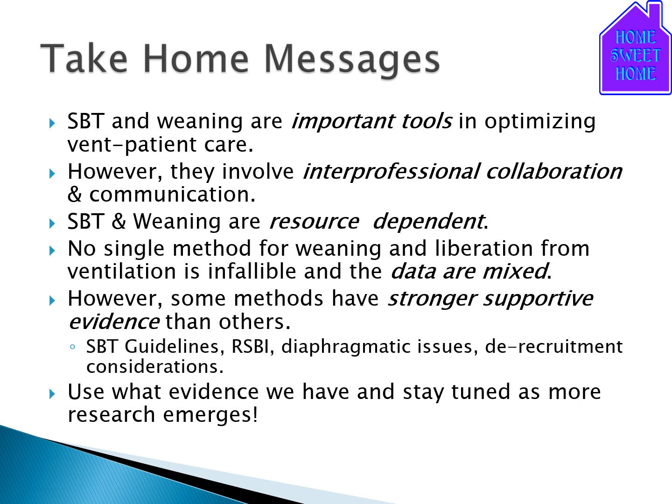So let's look at some take-home messages here. Spontaneous breathing trial and weaning are important tools, or important goals, actually, and tools in optimizing ventilator patient care. However, they involve interprofessional collaboration and communication. Spontaneous breathing trials and weaning are resource dependent. So you got to have the proper amount of resources. If you're going to extubate patients to BiPAPs, you got to have enough BiPAPs. You got to have enough staff to actually be doing that. Your protocols are a form of a resource, that actually often can represent an efficient use of resources.